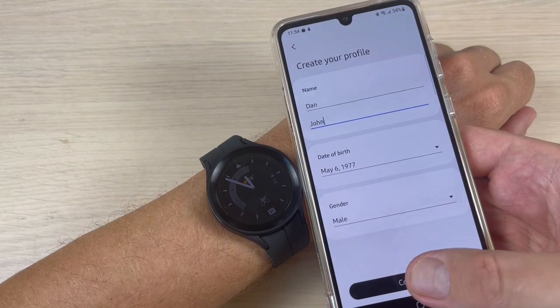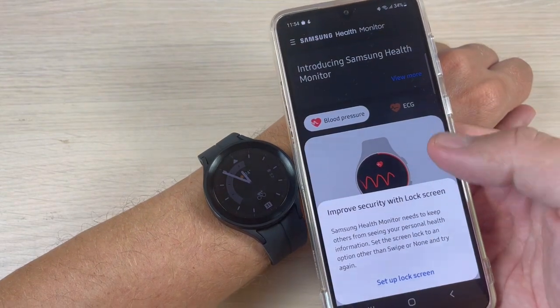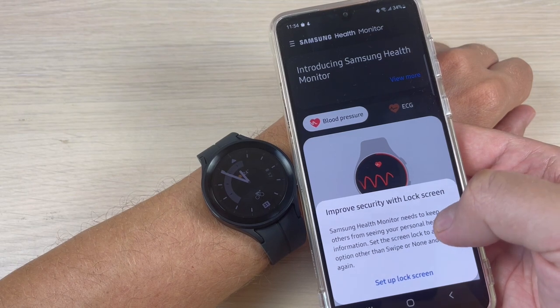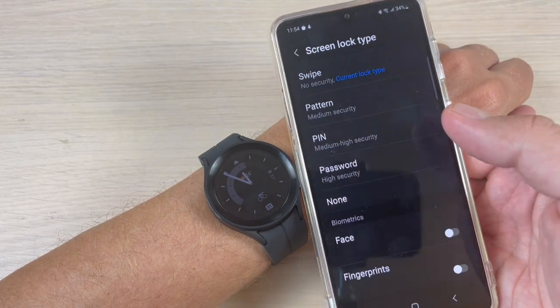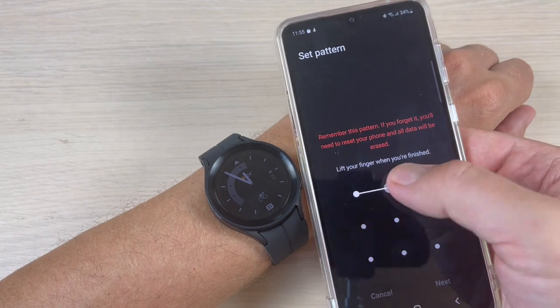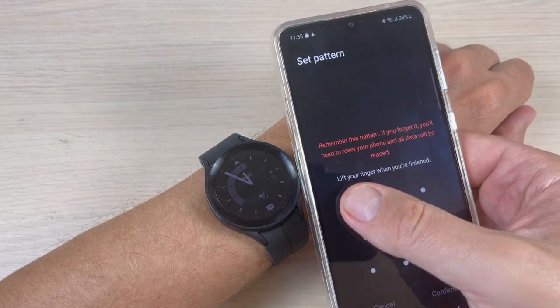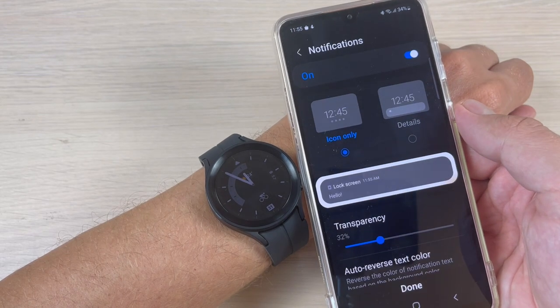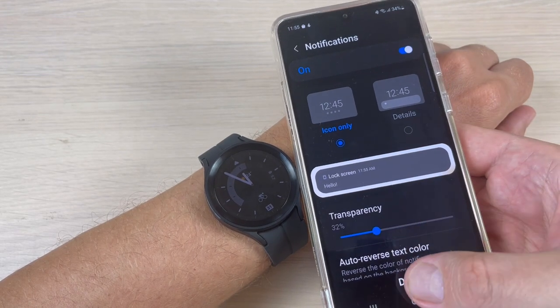Now press 'Continue'. Samsung Health Monitor needs to keep others from seeing your personal health information, so you need to set up a lock screen. I will set up a pattern, then confirm, and now just press 'Done'.